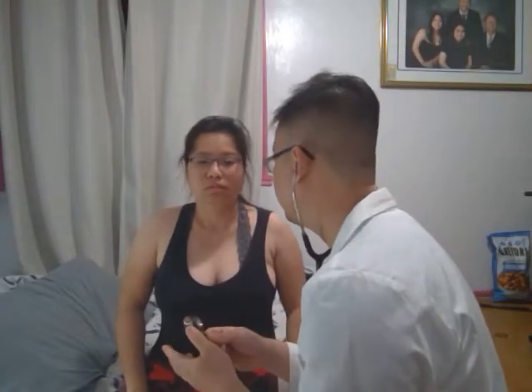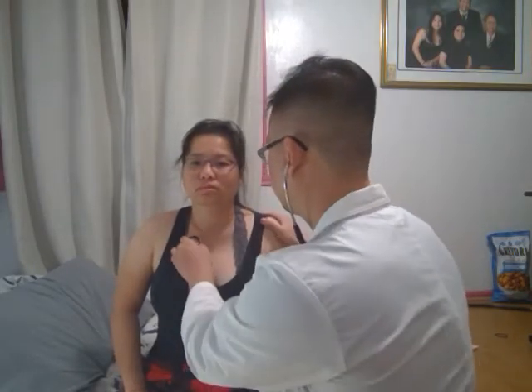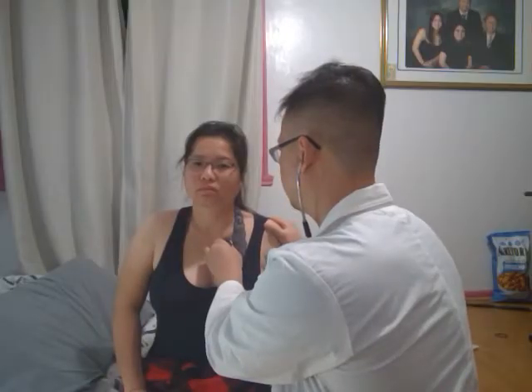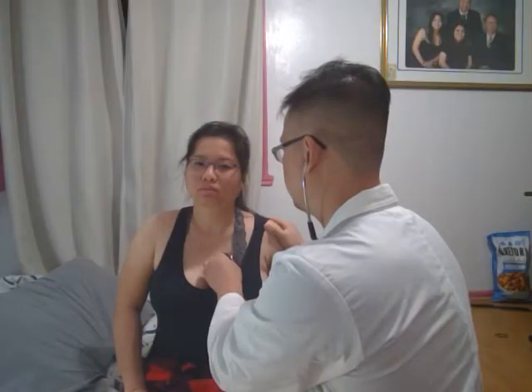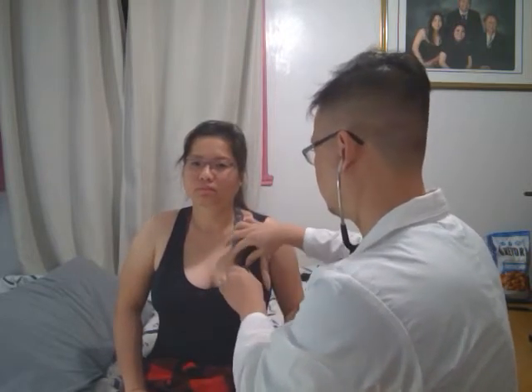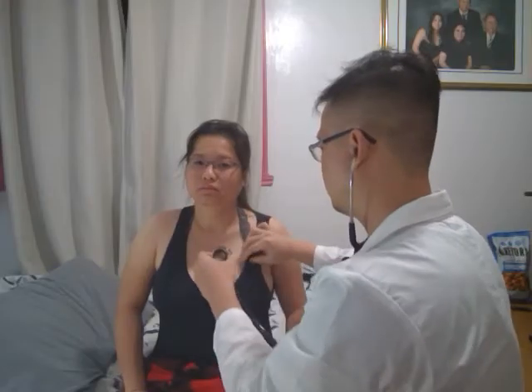I will listen to your heart, okay? I'm going to change to the bell.